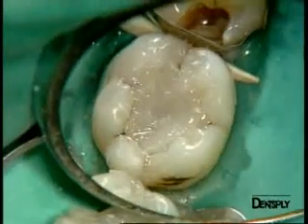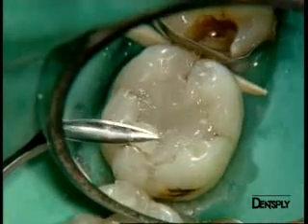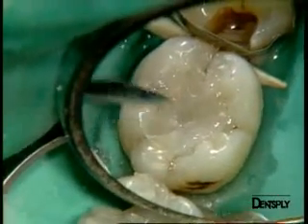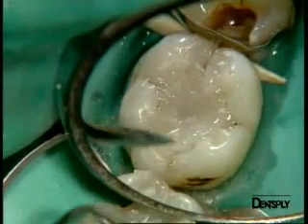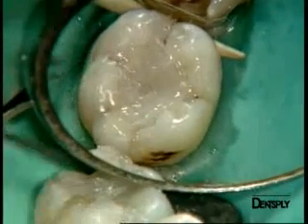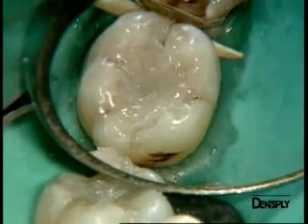We cure again, and see that we must still add a bit of material in some parts — for example at the distal part of the distal buccal cusp — and cure. Please note again that Quixfil does not stick at all to instruments.